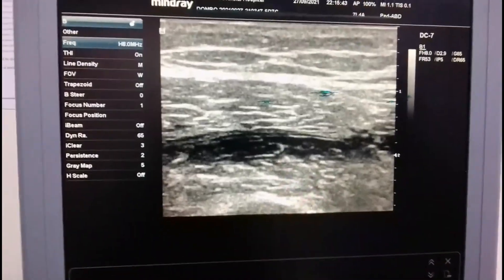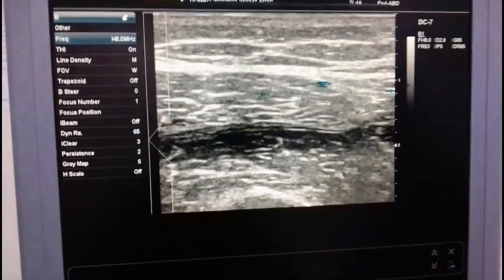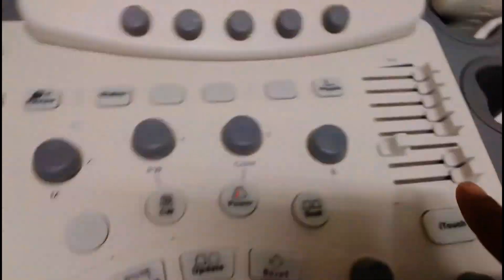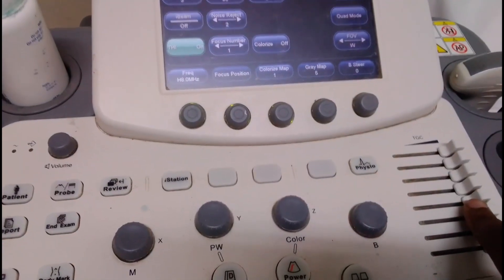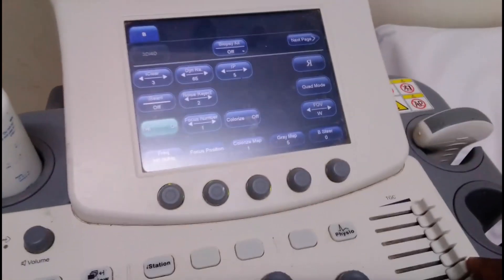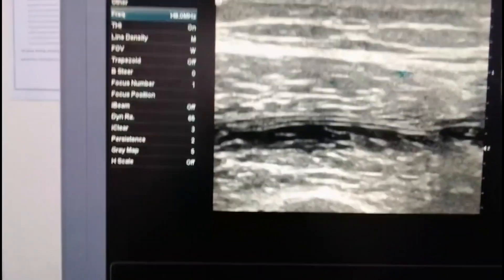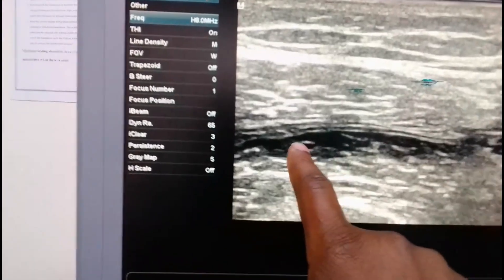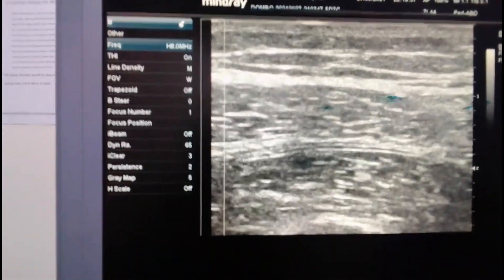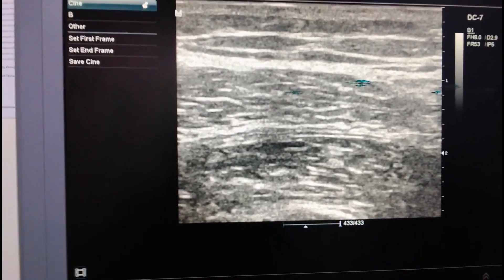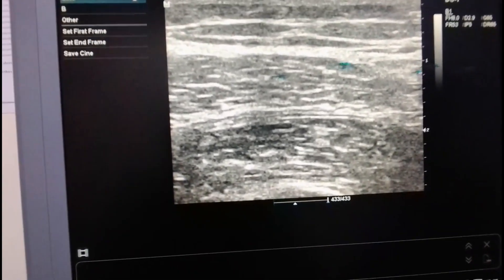But I can introduce artifacts myself. You see the line that I have introduced — so how did this come? I am making it disappear — it is gone. It's coming, it is gone, it's coming. By using just one key, if I move it here it disappears, if I move it here it comes. It is now looking like a blood vessel or another hypoechoic lesion going all the way. So some of the lesions you see are artifactual — they are not real. You are creating artifacts and pathologies because you are not adjusting the time gain compensation. Let me remove it — it's gone. That's magic.